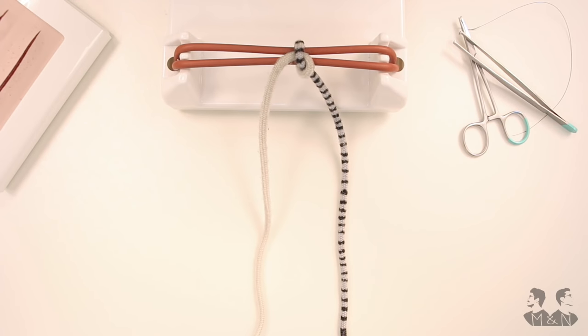Now, you made your half knot using the index finger of your right hand. The same procedure is possible with your left hand too.